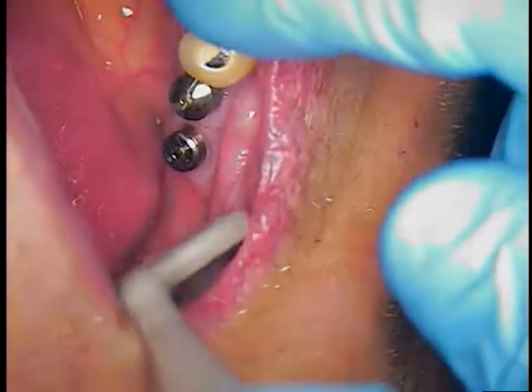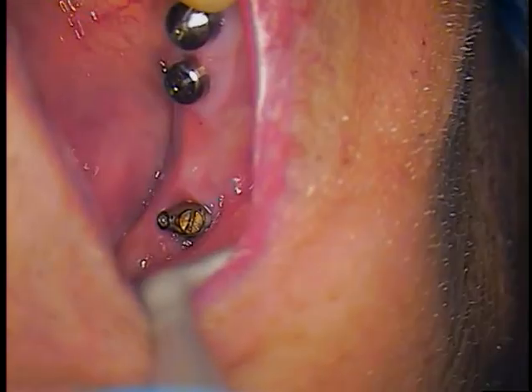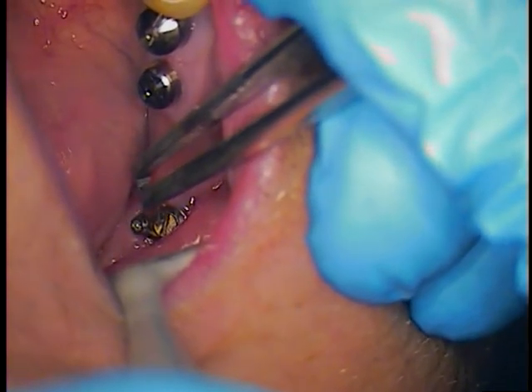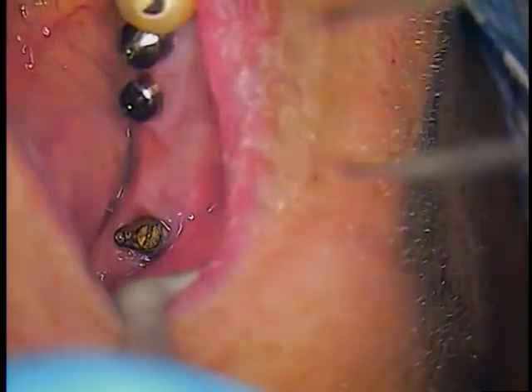You can see that one has a flat head screw because it's coming from a different angle. So that angle's in, and there's the flat head screw with a definite angle out. There's a screw going this way and one going that way, and then a third screw — so there are three screws to this component. Why don't you close and rest. I'm going to see if I can find a longer abutment, and we'll come right back on the next clip to cover that.